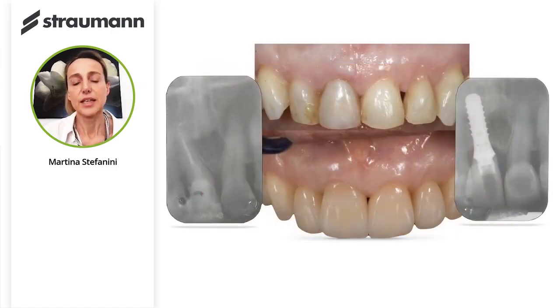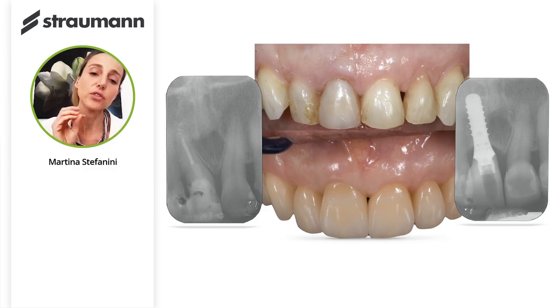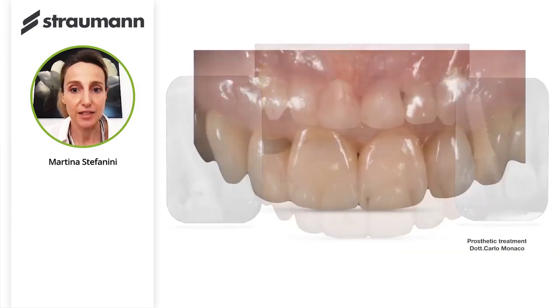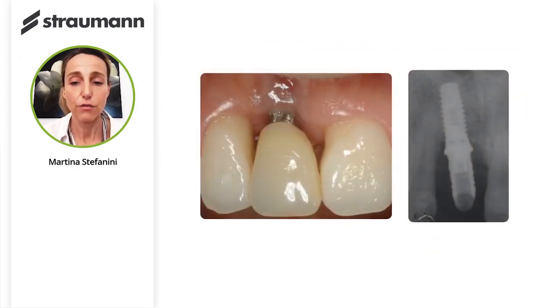And this is the nice final result in this surgical procedure that combines the coronally advanced flap with a connective tissue graft simultaneously to implant placement. We are able to create the right supracrestal soft tissue in both height and thickness, and this ensures a nice aesthetic result for our patient.